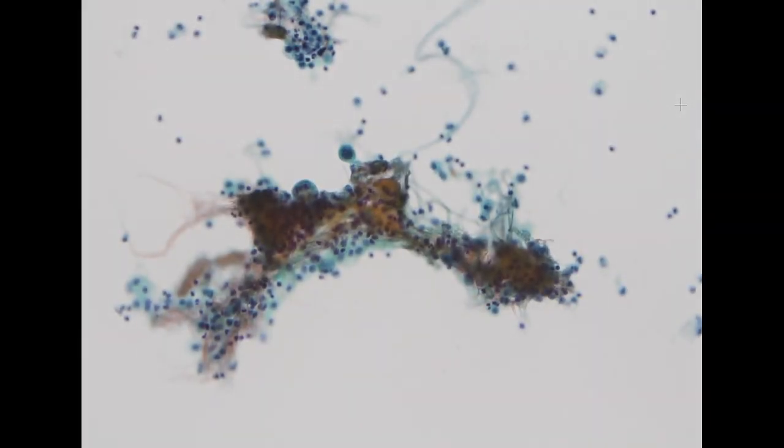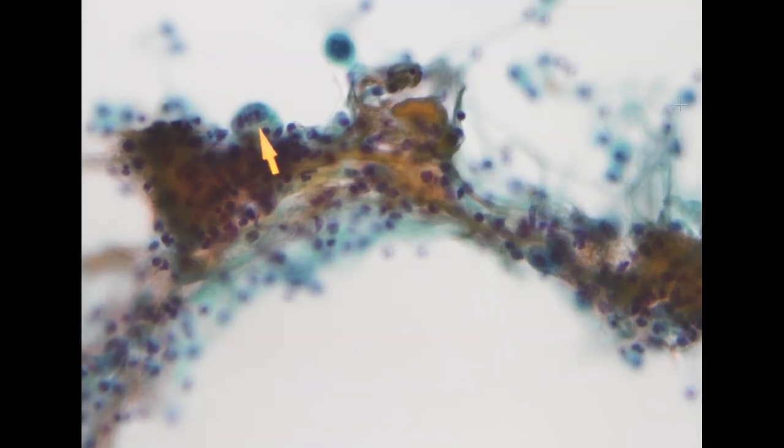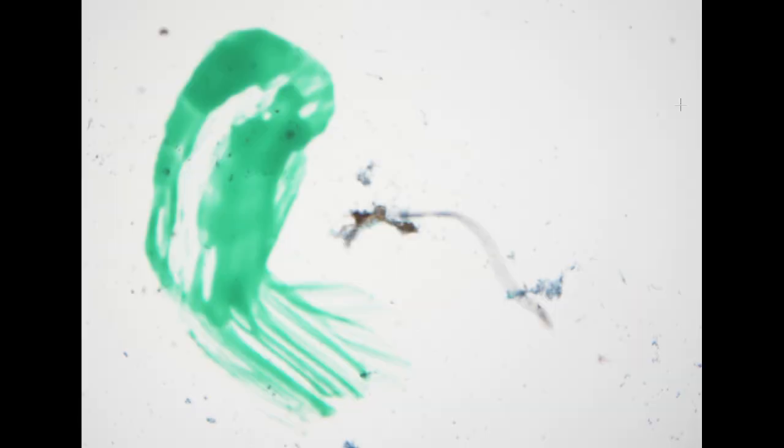As we know, in pancreatic cancer, sometimes the metastasis in the pleura, in the body fluid, can be very, very scant. So you really need to pay attention to single cells with nuclear atypia or with intracytoplasmic mucin. So again, here we see other cells with some mucin in the cytoplasm. So this is metastatic adenocarcinoma.